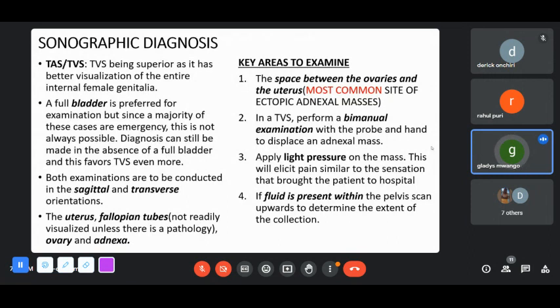You can also try and remove the tissue harmonics. That in a way can improve your depth, so you get a more black and white image. But if you want to look at the gross, at least find out where the placenta is, the fetal heart, if you're doing gestational age, you may be able to assess that.